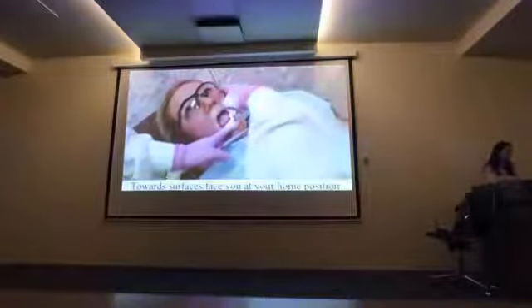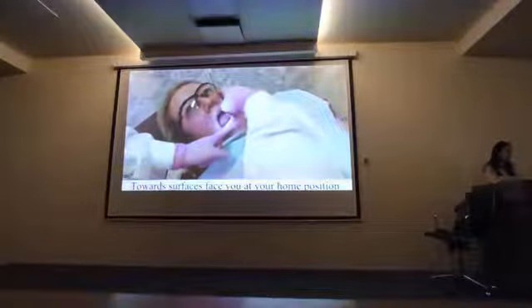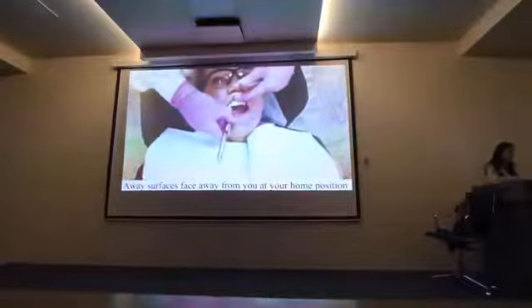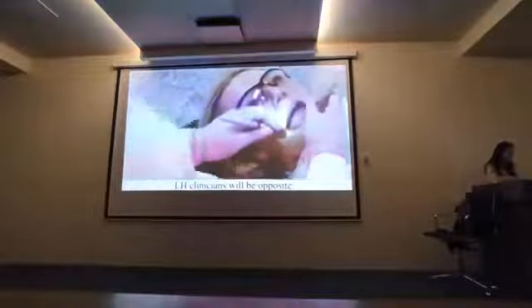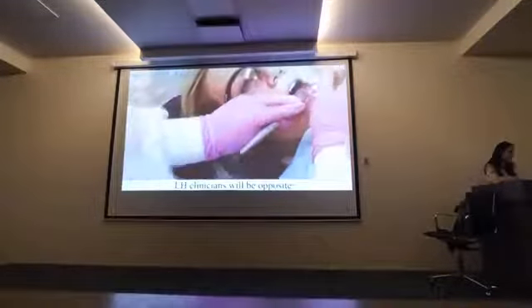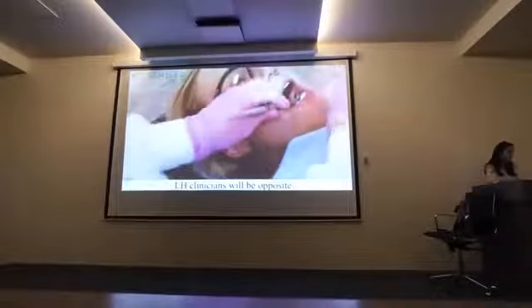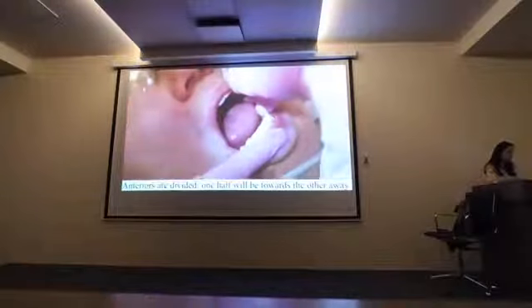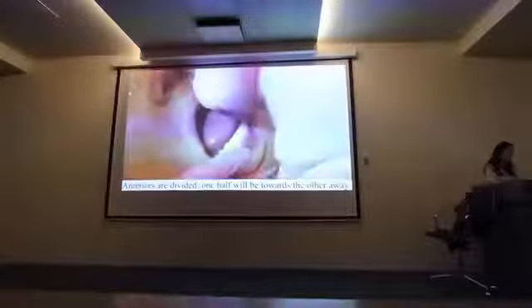I will scale surfaces of the teeth based on them being towards or facing me here at 9 o'clock, or away from me at the 9 o'clock position. For example, sitting in the 9 o'clock position, I'm going to scale surfaces of the teeth that are towards or facing me, which are the posterior buccals of quads 1 and 4, and in quads 2 and 3, the posterior linguals.